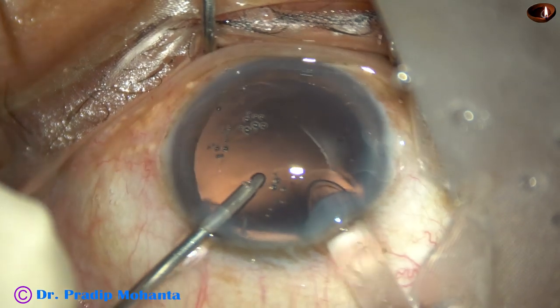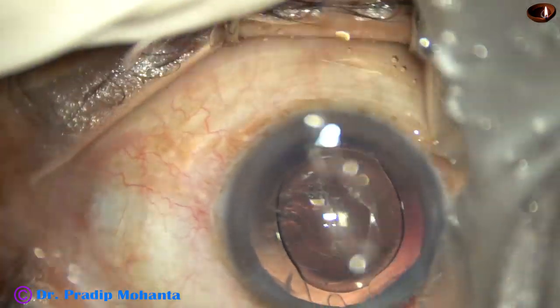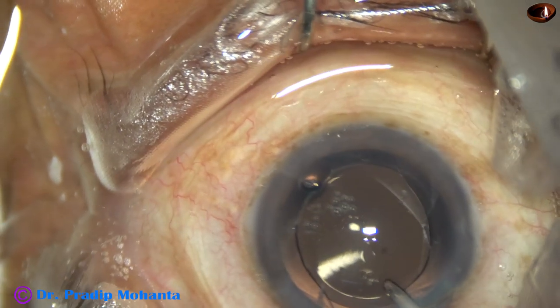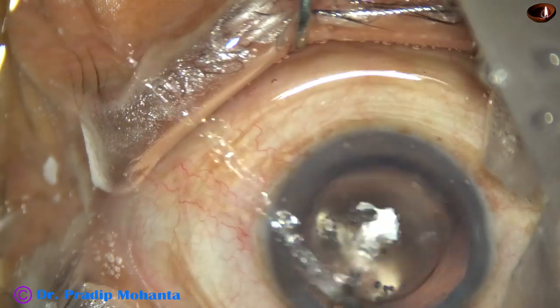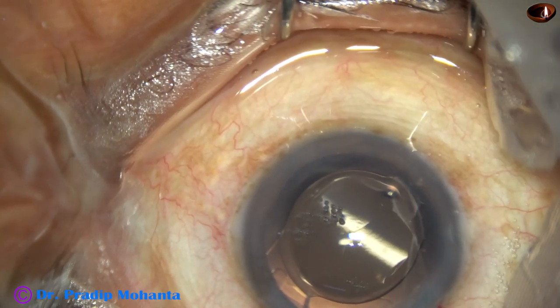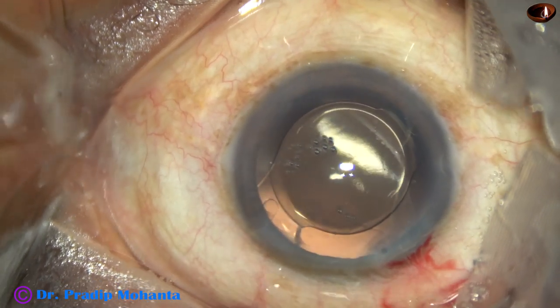This is hydroimplantation of a monofocal single-piece intraocular lens. The lens goes into the capsular bag. There is some visco in the anterior chamber; it is irrigated out. Now we are towards the end of the surgery. We just have to close the side ports by hydrating the corneal stroma. I conclude the case.